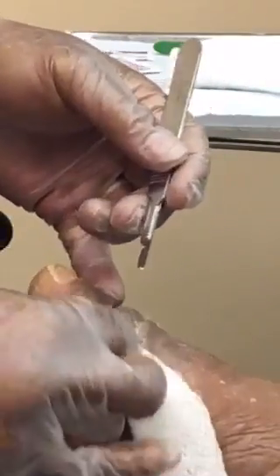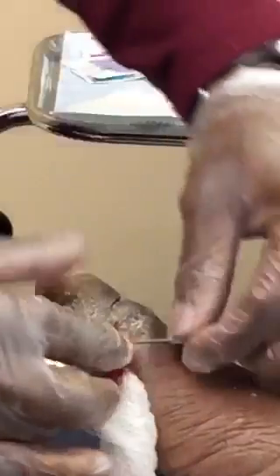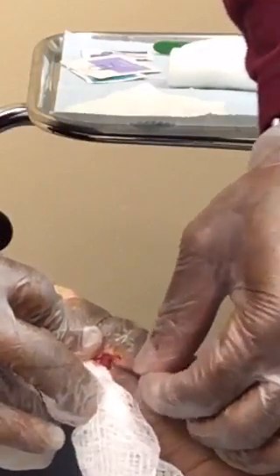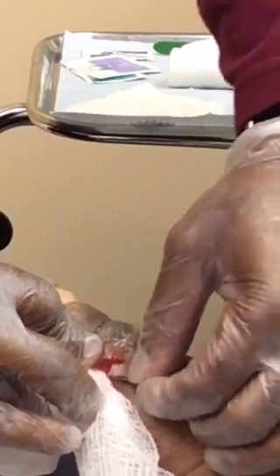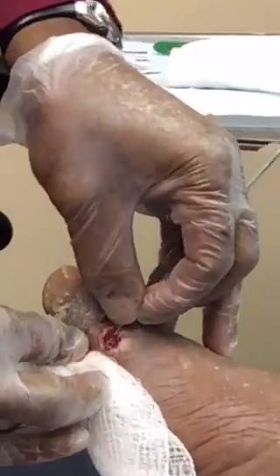There's good granulation tissue there — nice bleeding. Now what I'm going to do is take the edges down a little more; they're a little thick for my liking. You want the edges of the wound to be level with the surface of the wound. Skin will not grow uphill or downhill — only straight across.